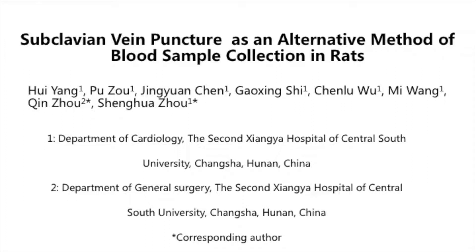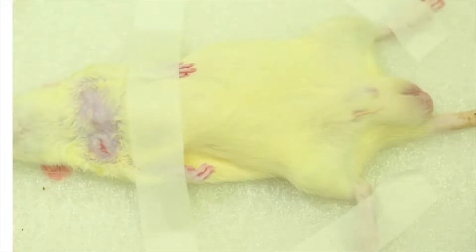Subclavian vein puncture as an alternative method of blood sample collection in rats. After general anesthesia, place rats in supine position and sterilize the infraclavicular space with 75% ethanol. Identify the superior sternal fossa before puncture.